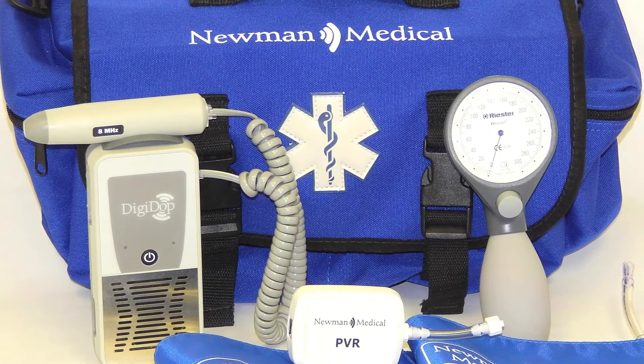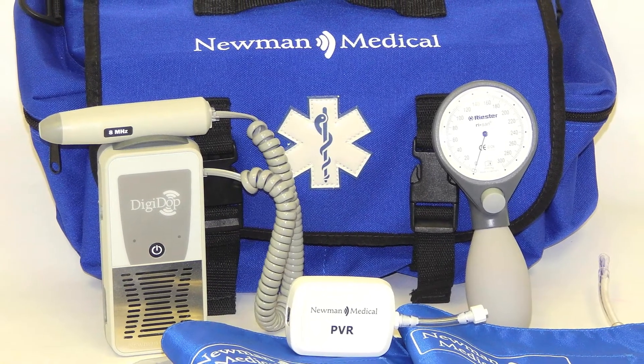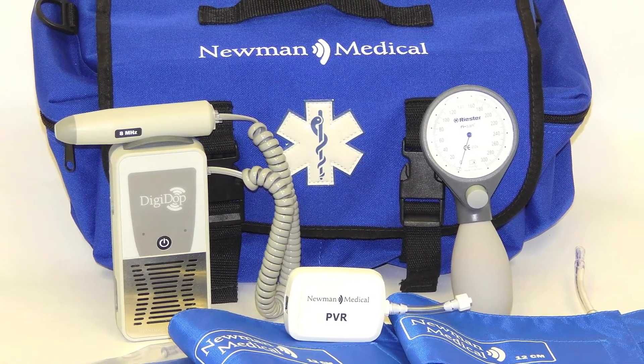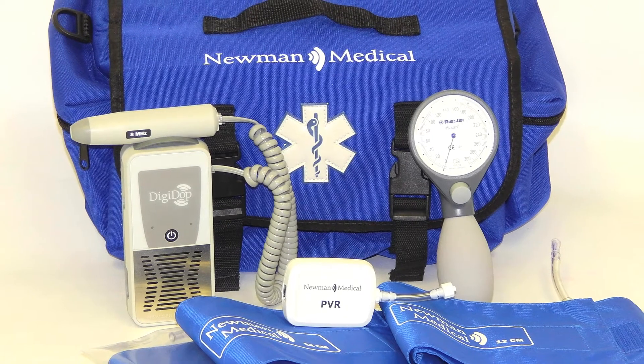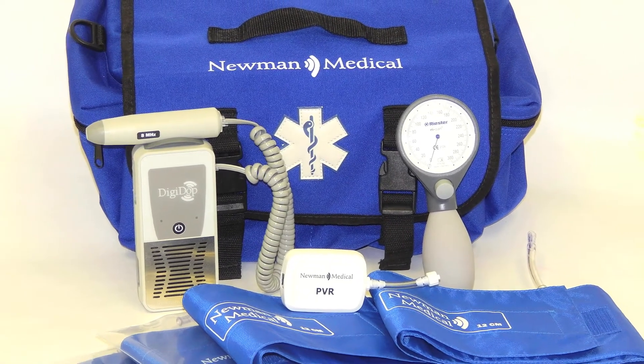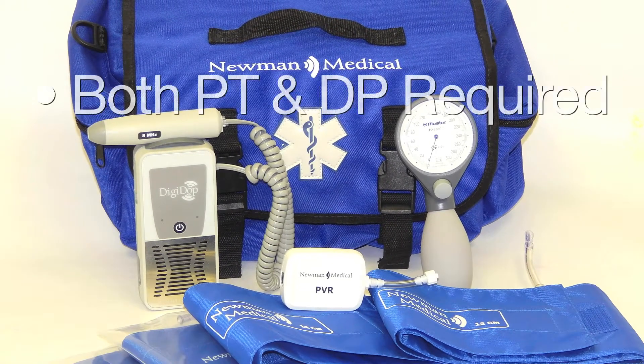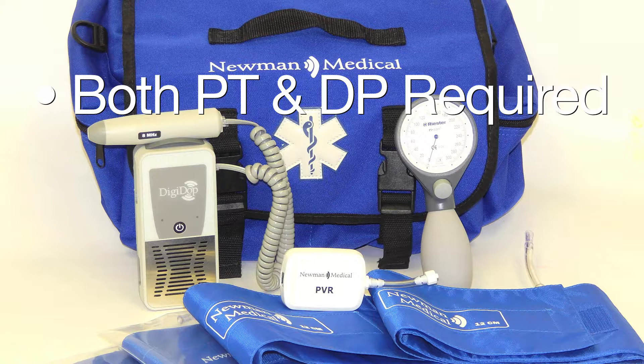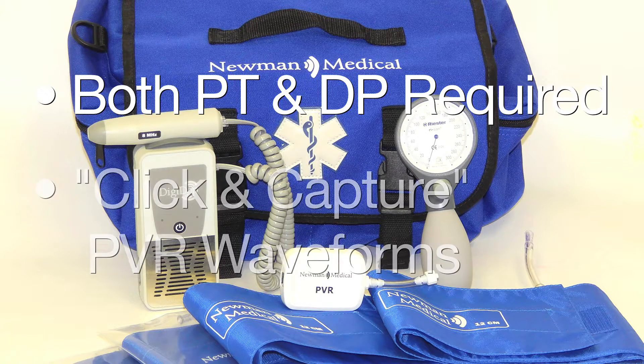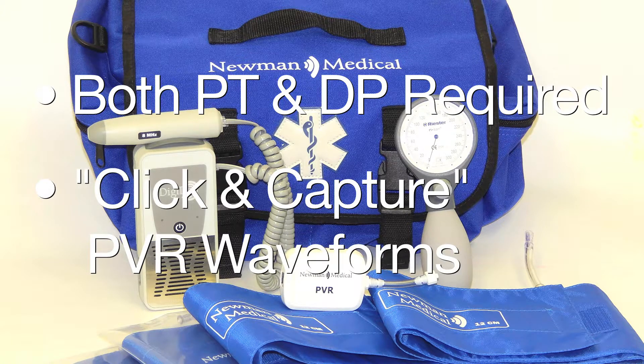Simple ABI systems assist in performing this test quickly and accurately, following the clinical and CPT recommendations for the ABI exam. These recommendations include obtaining the systolic pressures using a Doppler at both the PT and DP arteries at the ankle and including a Pulse Volume Recording, or PVR, waveform at the ankles.